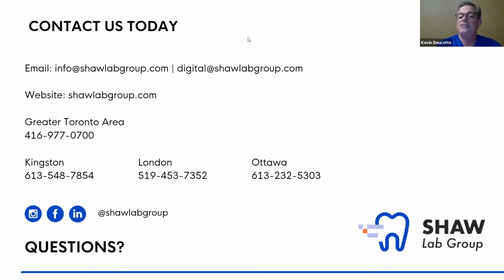Your take on that, Amanda? Yeah, it really depends on the designer and how much experience they have. Some people are very quick. I would say I'm more on the quick side of designing, but I have a lot more experience. We design thousands and thousands of crowns in a year. Some people take a bit more time. The implants take longer, anteriors take longer. So it's anywhere between maybe 10 to 20 minutes, depending on the complexity of the case and who's doing them. It could be different all the time, and it's true what Kevin said, that there's no typical crown. We don't have a standard that we always see.